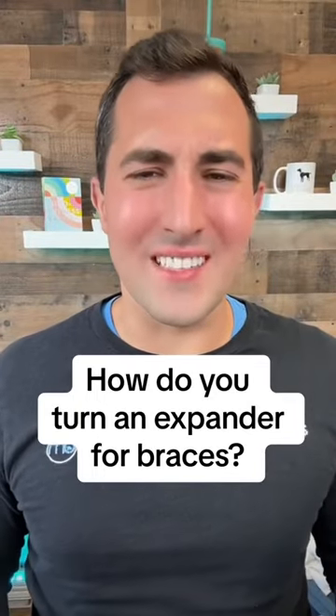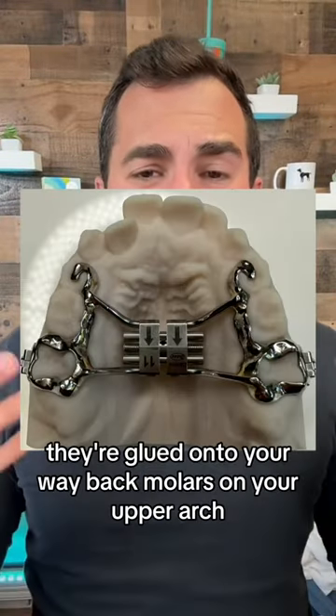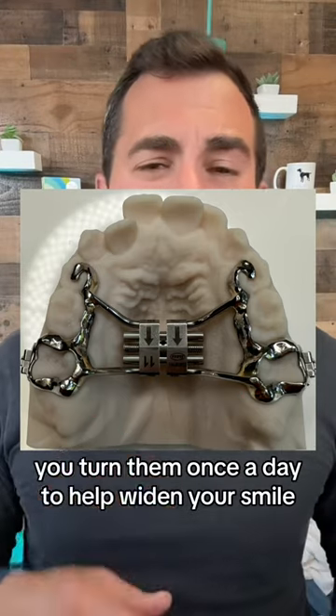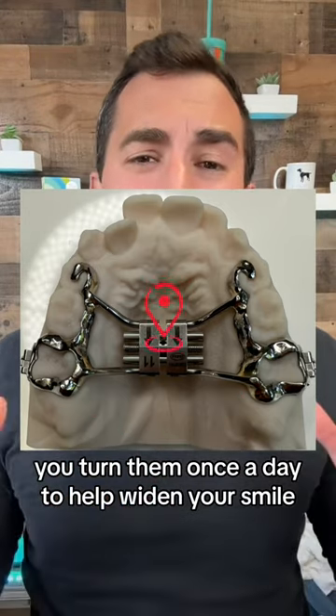How do you turn an expander for braces? This is what they look like. They're glued onto the way back molars on your upper arch, and they rest on your palate. We turn them once a day to help widen your smile.